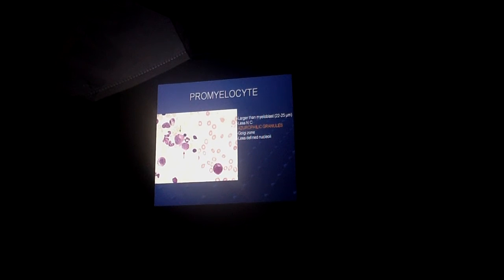What is the other name of the azurophilic granules? Primary or specific? Primary. Very good. Now, isa pa lang na type of granules ang makikita sa kanyang cytoplasm. So these granules can be colored blue or violet. So that is now the appearance of a promyelocyte. So compare the appearance of the cytoplasm, which contains granules, as to the cytoplasm of a myeloblast. So the cytoplasm is clean looking as compared to the dirty looking granulated cytoplasm of a promyelocyte.